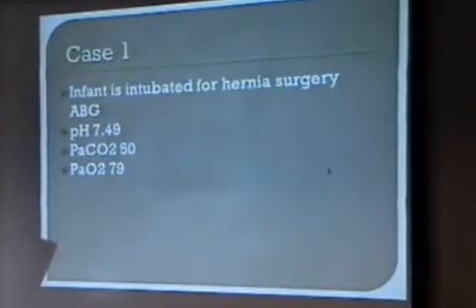If this blood gas alone, I would call it this. I would call it metabolic alkalosis compensated for by respiratory acidosis. Why am I calling it, why would you call it, what would you call it? Tell us. This is the only blood gas we have. We don't have anything else. What would you call this one?